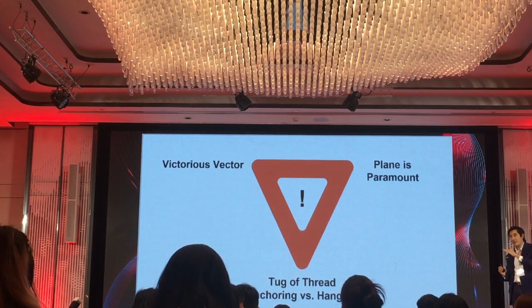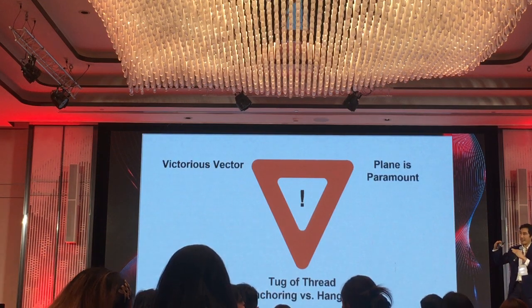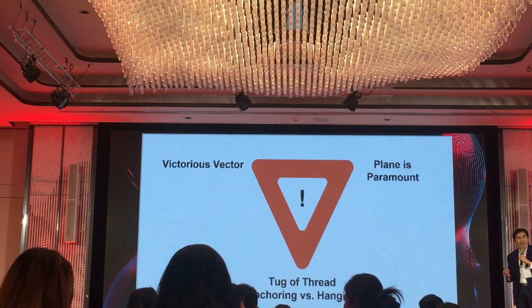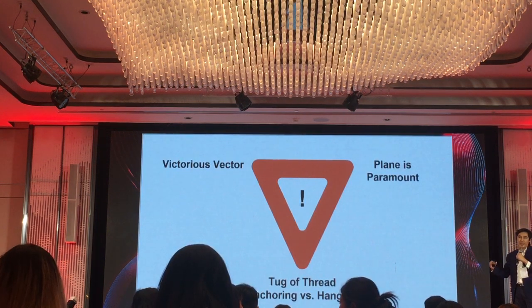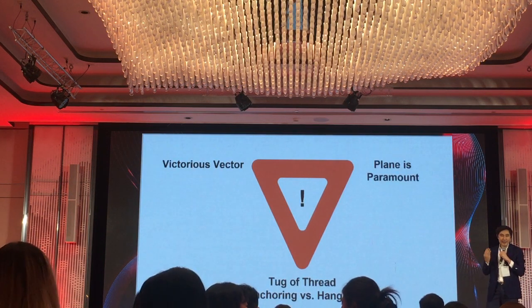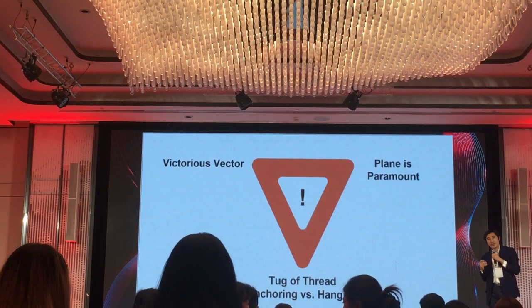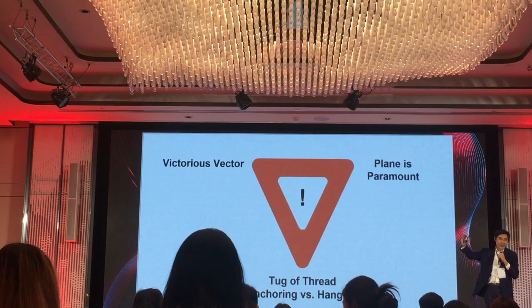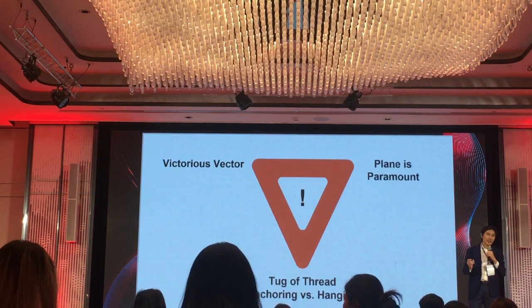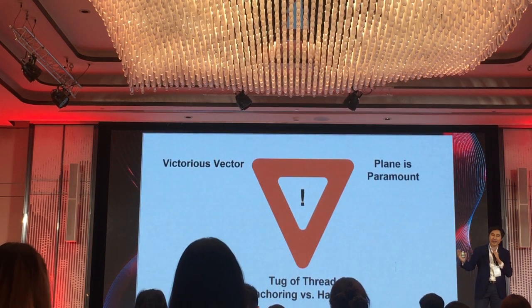In the superficial layer, like the subdermal layer, we can stimulate collagen, and in the mid subcutaneous plane, we can create more lifting. If we go deeper, we may create more volume for the tissue and a kind of lifting that is more natural than in the subcutaneous tissue. I want you to think about filler. Superficial injection and deep injection give different results, just like threading. A thread in the superficial plane and in the deep plane will provide lifting with different characteristics.